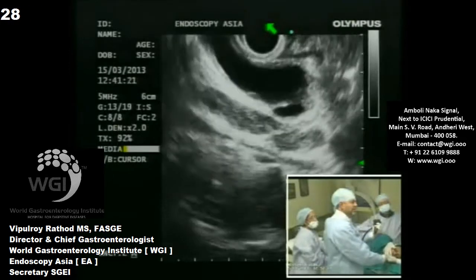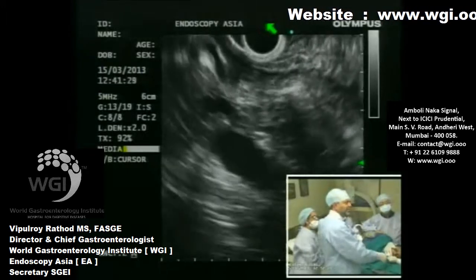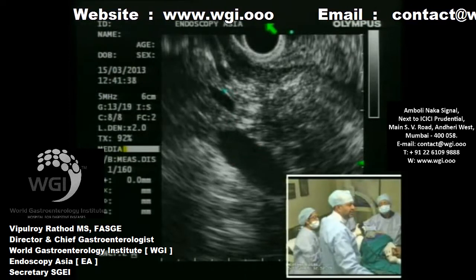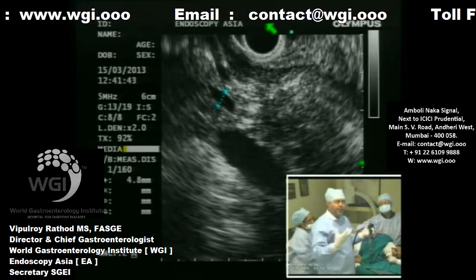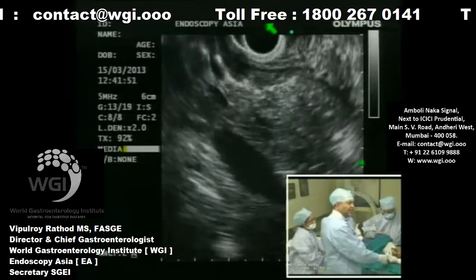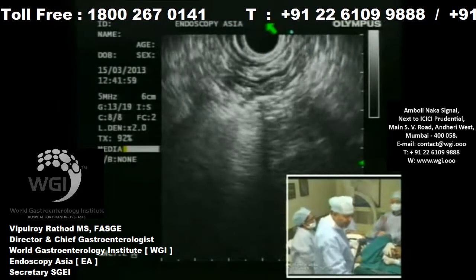What is this? That's the gallbladder with sludge. You can see gallbladder with sludge here. So part of the bile duct you saw. There is edematous pancreas. You can see the pancreatic duct is a little prominent here. This is the pancreatic duct. We all know that the pancreatic duct may not be prominent in autoimmune pancreatitis, but there are cases where we will have a prominent CBD and prominent pancreatic duct in a case of autoimmune pancreatitis. So I've seen the head of the pancreas, I saw the bile duct, I saw the pancreatic duct. Let me see the pancreatic body and the tail.